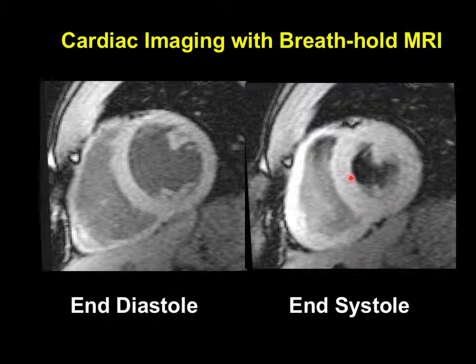This is a normal 22-year-old grad student, right? So it's a really healthy heart. You can see it's perfectly symmetric and the thickening is really nice and everything like that.